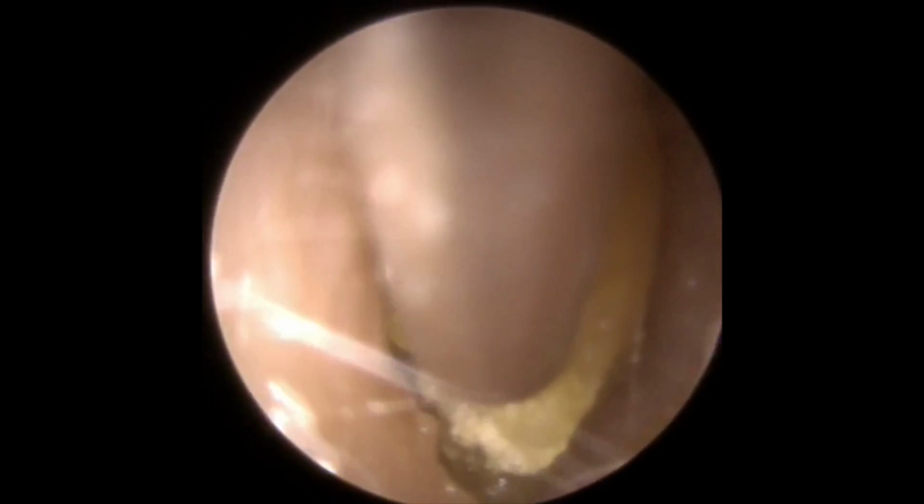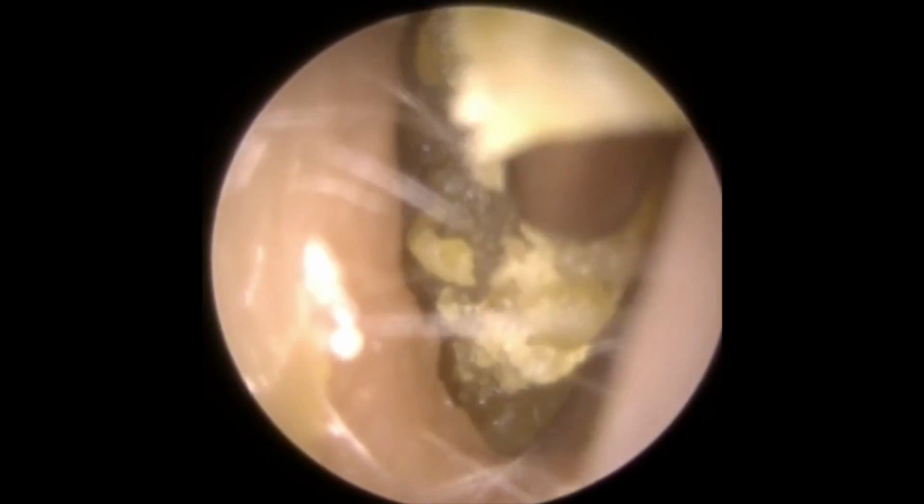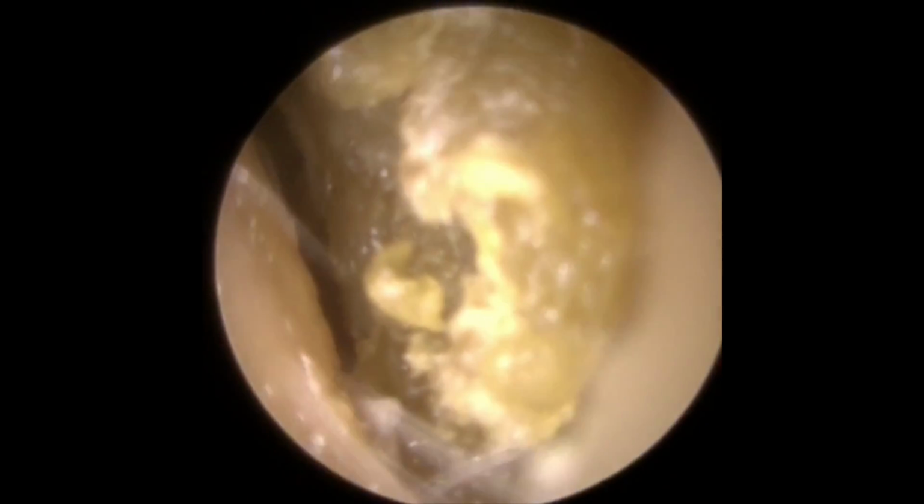So to give that right hand side a bit of a rest, I'm trying to move the wax now across to the left hand side. You can see there's a little bit of movement to it. Trying to turn it, trying to bring it from the right to the left, trying to guide it into the entrance, you can see with the camera there. But it's just getting wedged, which means the back end of this wax is probably larger than the front end. So as I'm trying to maneuver it at the front section, the back section is restricting the amount of movement we have.